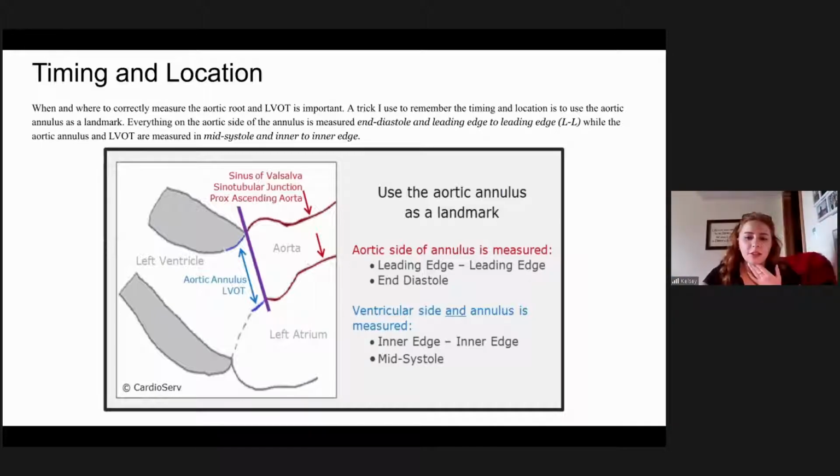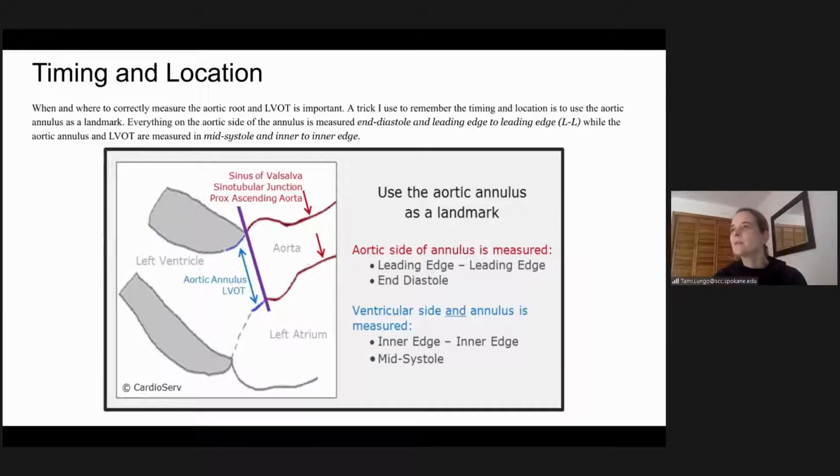And so basically that's just making sure that our conservation of mass is actually correct, like what goes in, what comes out. Yeah, when we do our mass, we do a cross section at the papillary level. But yes, it's basically saying at the level that I measured this velocity is where I'm measuring that same distance.